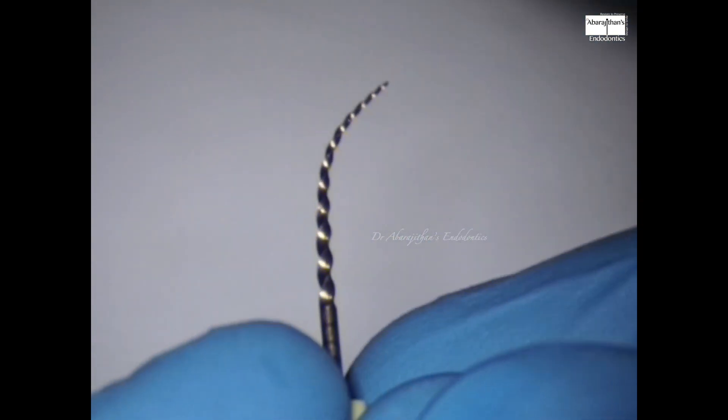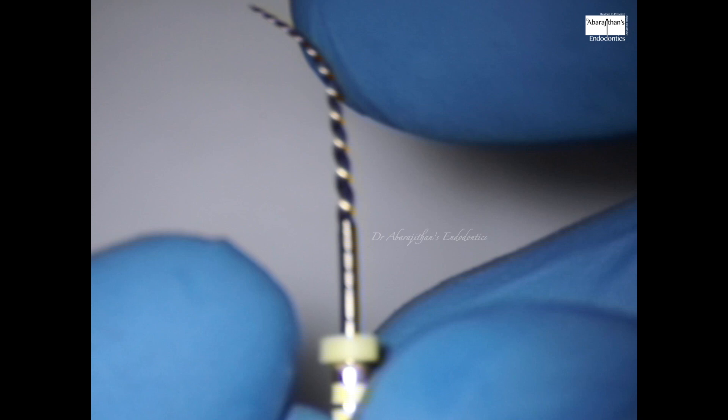Whenever I receive a new file, the first thing I do is the pre-bendability test, because all these heat-treated files have this property which is very useful in areas with limited mouth opening or restricted access. This file was nicely pre-bendable and did not have much shape memory. The best way to clinically evaluate this file is through clinical demonstration on three molars rather than on a simulated canal or acrylic block.